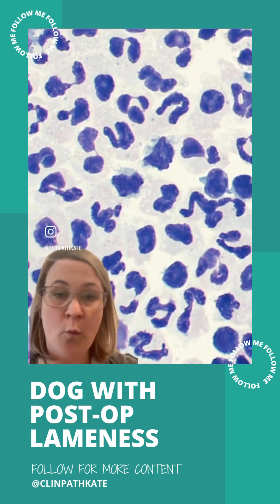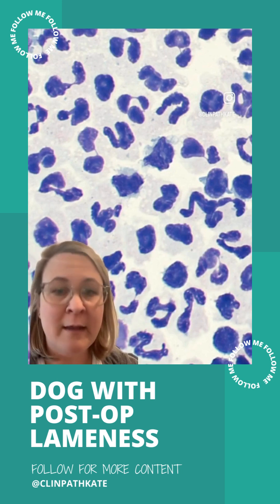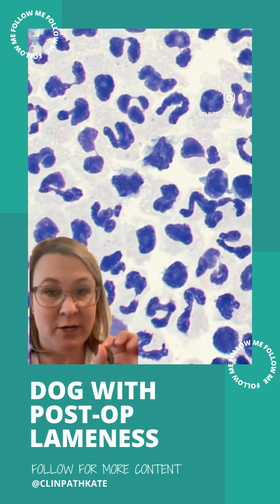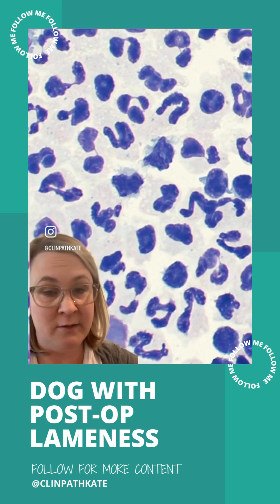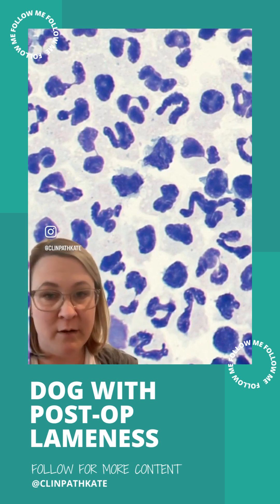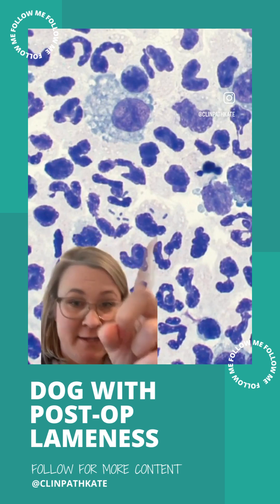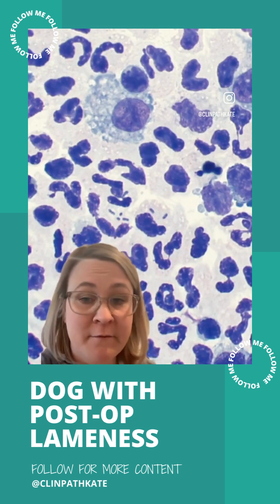It was wall-to-wall neutrophils — definitely not normal in a joint. Joints really should be very low cellularity normally. This was insane. Tons of neutrophils, which we can see here, and importantly they look degenerate, meaning that their nucleus is really puffy. That makes us very concerned that there is bacterial infection going on. And we actually didn't have to look around very long to find the bacteria. Here in these two neutrophils there are little rod bacteria in the cytoplasm, confirming bacterial infection. This is a septic joint.